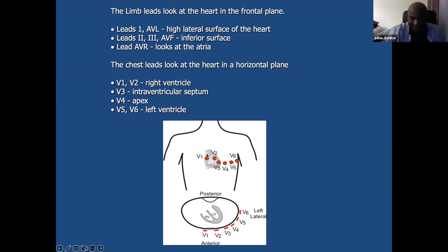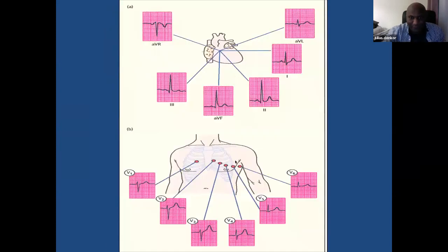And the reason why, I think we go back here, when you have your ECG transition, when you've got your V3 and your V4, if I can, hang on. Click on that. Yeah. So if you look at B here, you see how from V1, you have your tiny R wave and you have a deep S wave. And that ratio changes as you move along the heart from the right to the left. When you get to maybe the apex, from V3 to V4, you can see the transition of the S wave and the R wave is changing there, especially in V4. It's a good transition there. So this is a normal transition when you're looking at your chest leads.